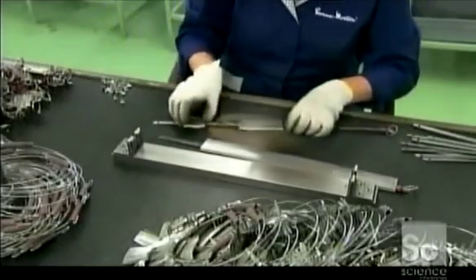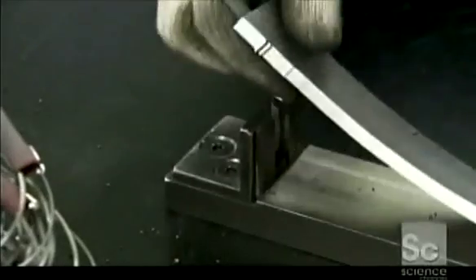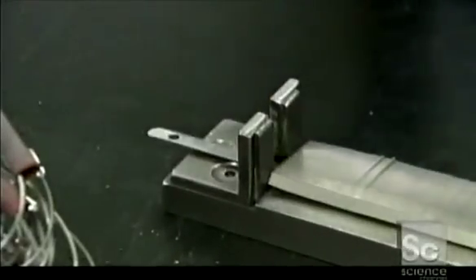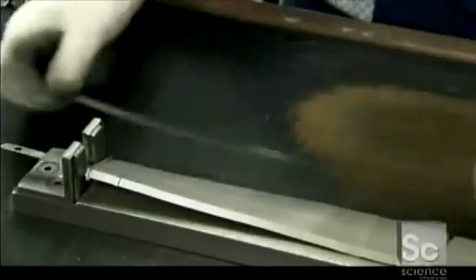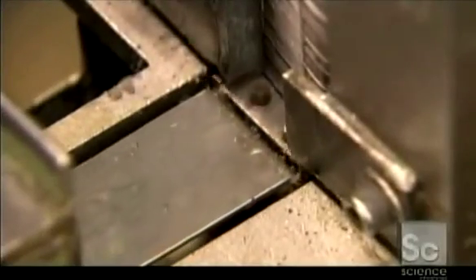They transfer the blanks from the ring to a metal rod, using a gauge to measure out the right number. From here, the rods are mounted onto grinding machines. Each one picks up a blank with a magnet, then places it in a holder.